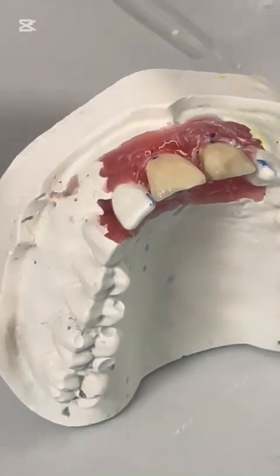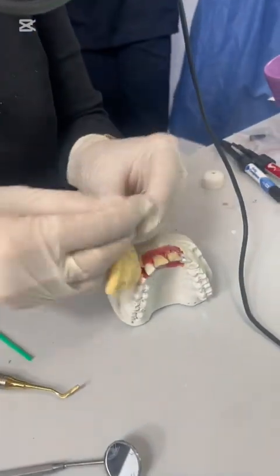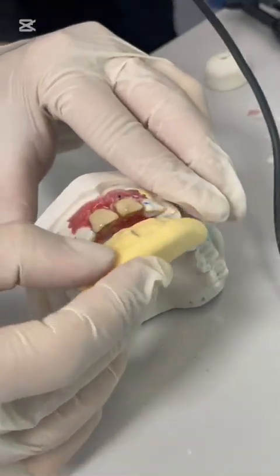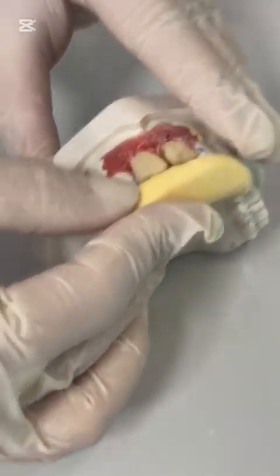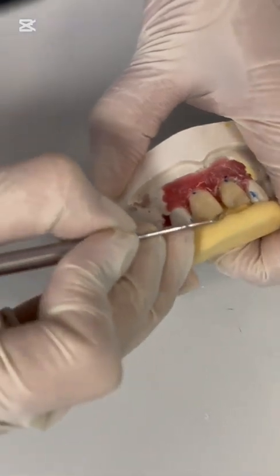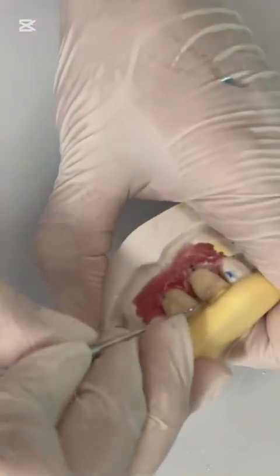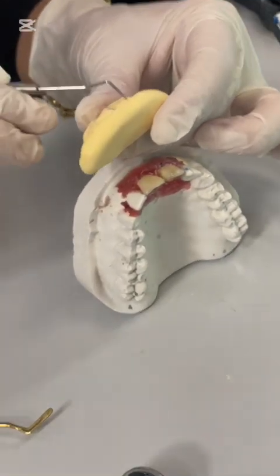Okay, now this is ready. Now we will apply the composite, the incisal portion of the composite, on the silicone itself. Then we will place it here. In order to understand the extension I need to add, I can make this line with the probe. Okay, so let's say this is my enamel composite, which is translucent composite.